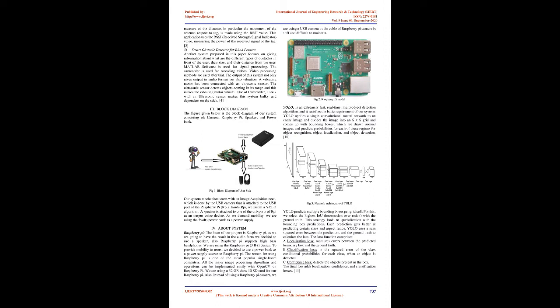2. Wearable object detection system for the blind. In this paper, the RFID device is designed as a support for the blind for the disclosure of objects, especially, it is developed for searching the medicines in a cabinet at home. This device can provide information about the distance of a defined object, how near or far it is, and simplifies the search. For identifying the medicines, the device can provide the user with an acoustic signal to find the desired product as soon as possible.